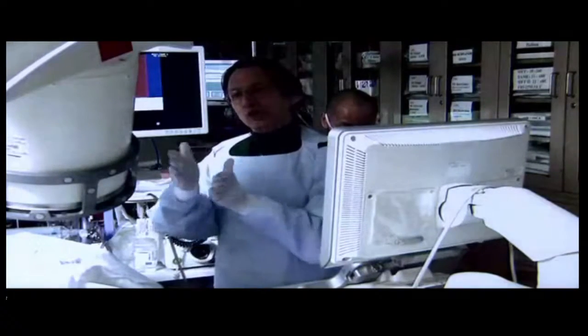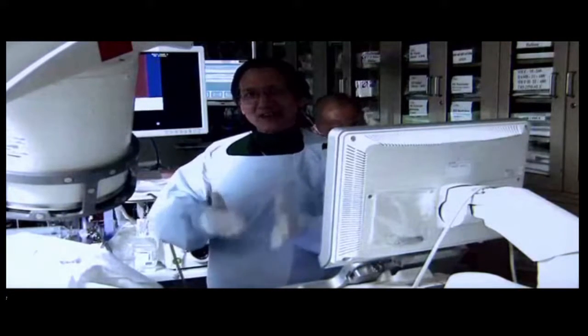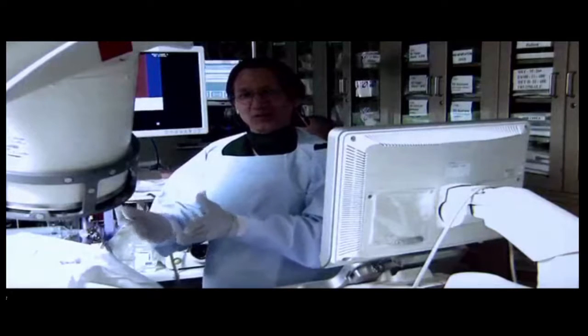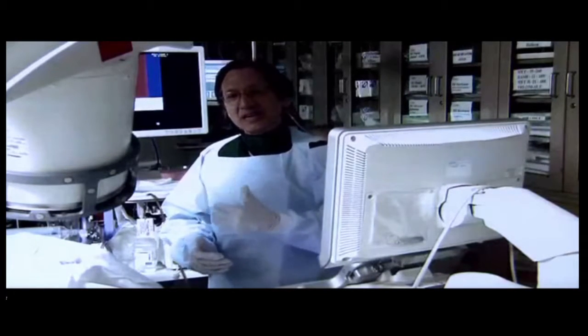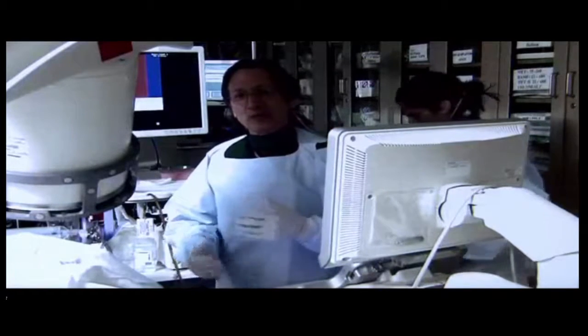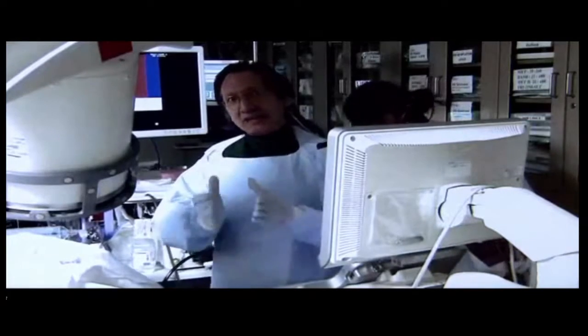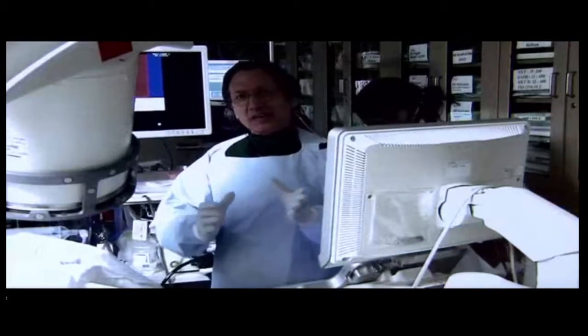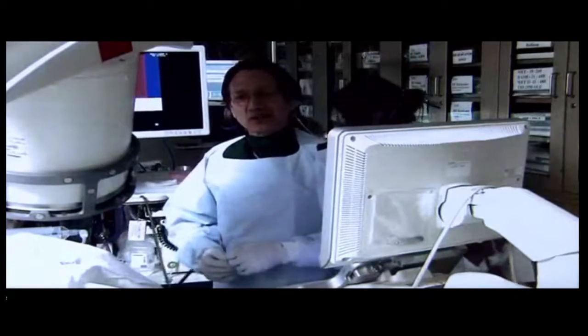So we're that much closer to the ideal hybrid scope that combines endoscopy and ultrasonography in the scope. I think this will be an advantage for those of us doing a lot of interventional EUS, because you definitely want good endoscopic visualization in conjunction with your ultrasound-guided intervention.